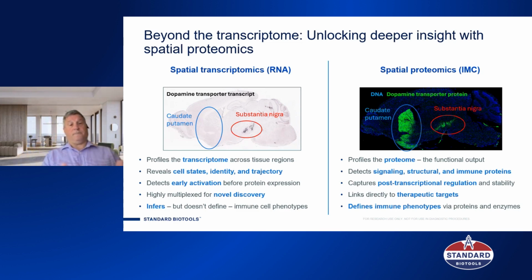And so I've got some points here about how they do different things, which is very true. I think it's safe to say that these are synergistic. What I think, though, is important as we grow into the immunology field is that, in general, the definition of what cell types are in immunology, the ontological definition of, for instance, a cytotoxic T cell or a Treg or a TAM, is based on protein. And people have tried to work out ways to infer that from immune cell phenotypes, but that is still just an inference and is not quite always correct. So the two really go well together.